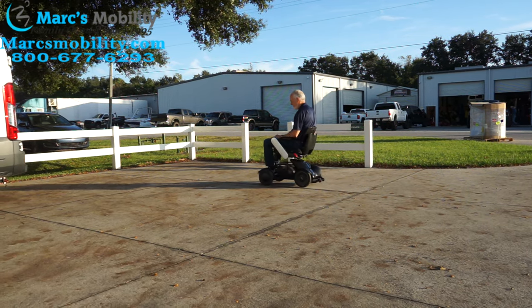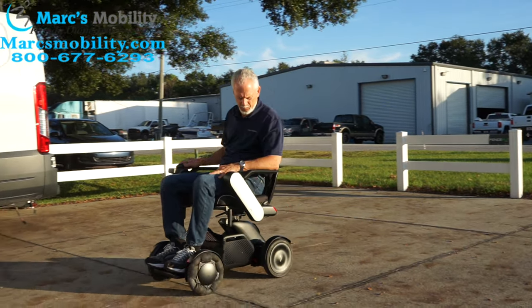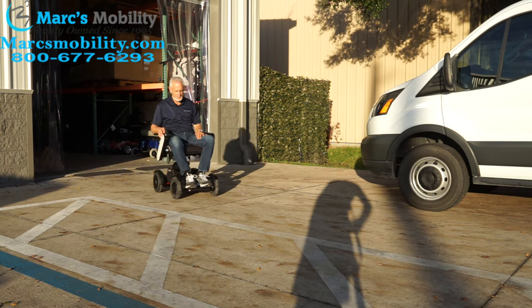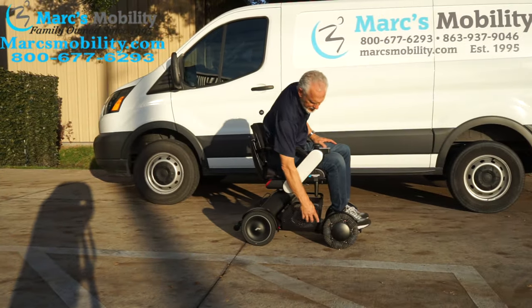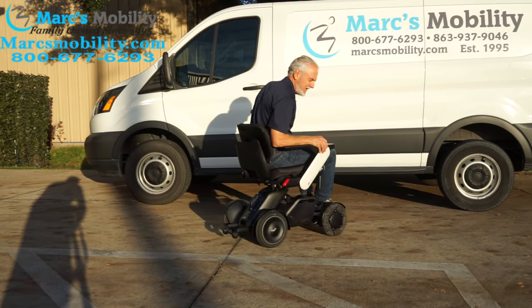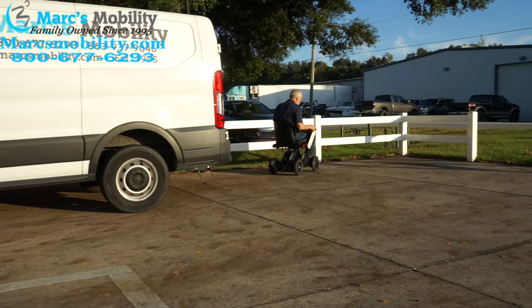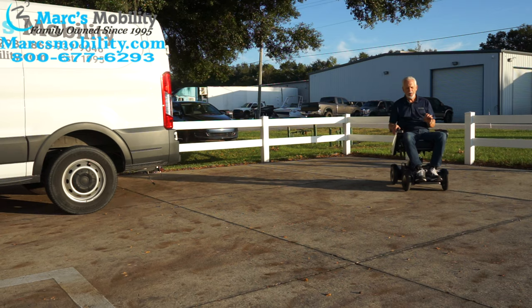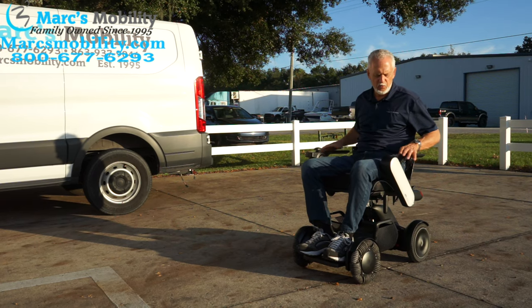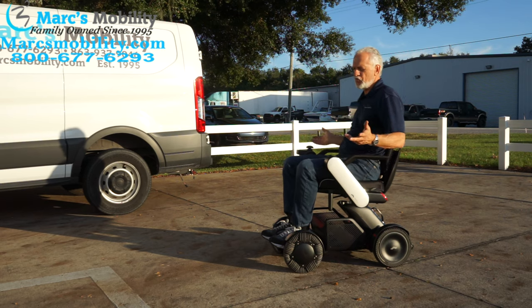This is the Will Power Chair, model number CI2. Top speed is 5 miles an hour. The front wheels spin on rollers, so when you turn, it looks like the wheel is dragging but it's really turning — it's really ingenious engineering. This chair is very well constructed and was very well packed in the box, which tells you how much they care about their product. It's a really solid power chair, and the seat is super comfortable — it is a low back, and it is super comfortable.